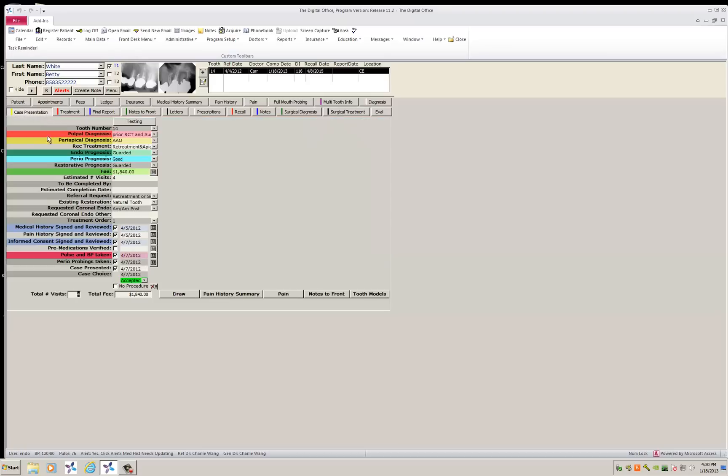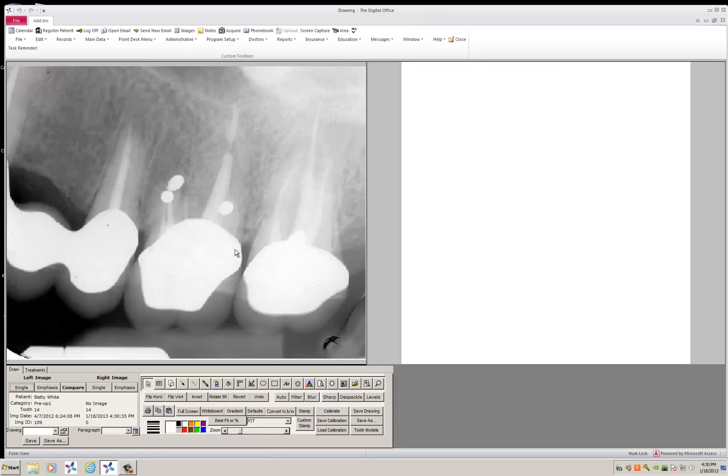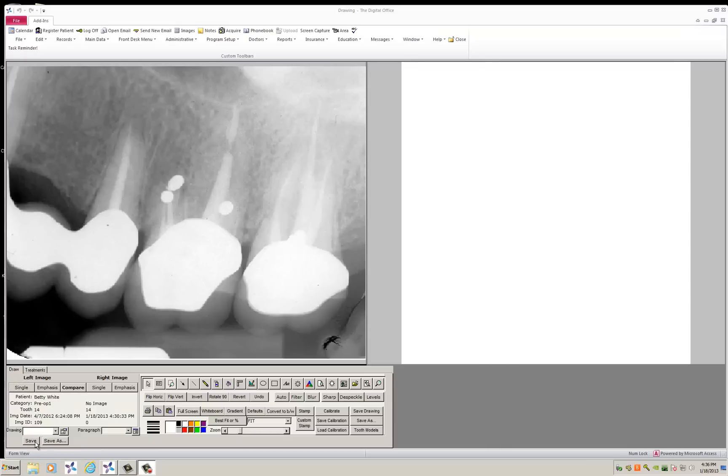To go to that, you go to case presentation, open the draw page. It posts the pre-op x-ray here and you have a side panel to the right that allows you to bring in diagrams.